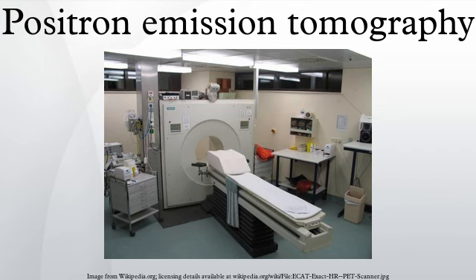A clear disadvantage, however, is that PET provides no timing information about muscle activation, because it has to be measured after the exercise is completed. This is due to the time it takes for FDG to accumulate in the activated muscles. Safety: PET scanning is non-invasive, but it does involve exposure to ionizing radiation.